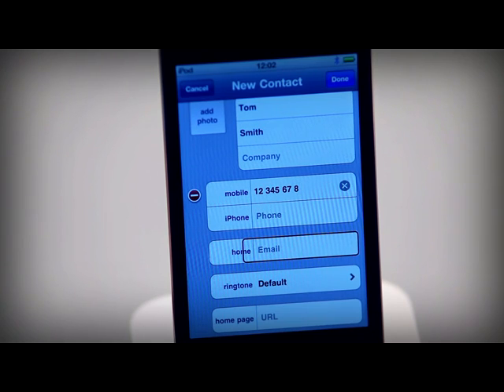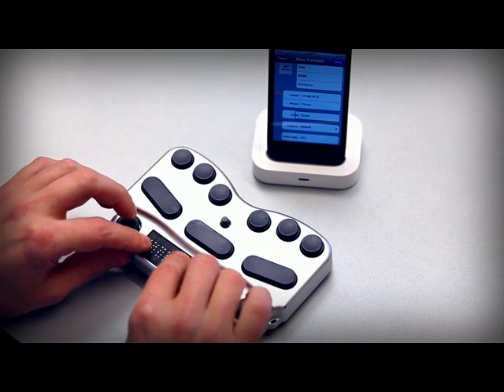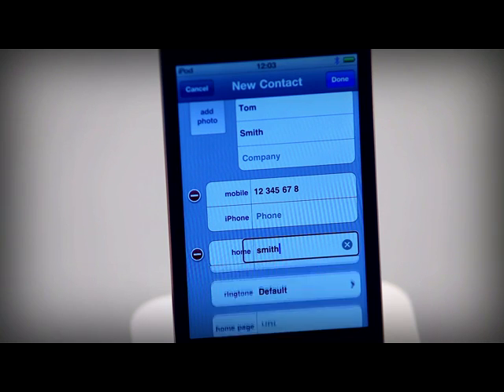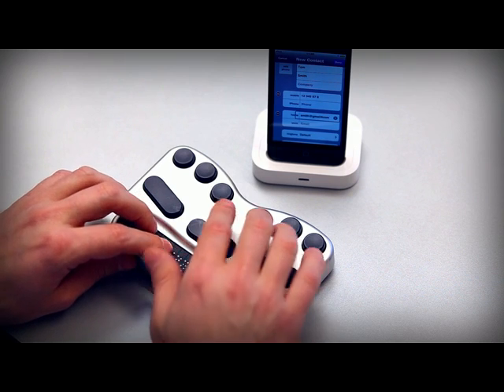You can add several phone numbers, and when you leave one phone number blank, you will move to the email details. As with the phone number labels, you can change the email address labels also, as well as add a custom label to the list. Type in the email address using dot 4 for the @ sign and dots 2, 5, 6 for the dot. Pause after entering the @ sign or the dot to let the Braille translation catch up.